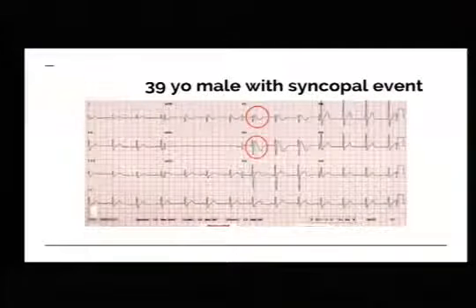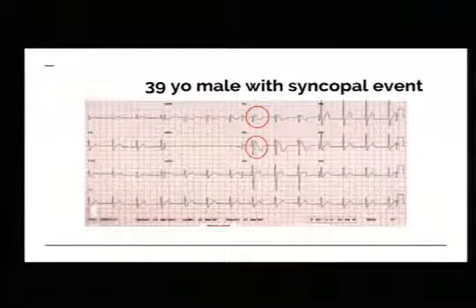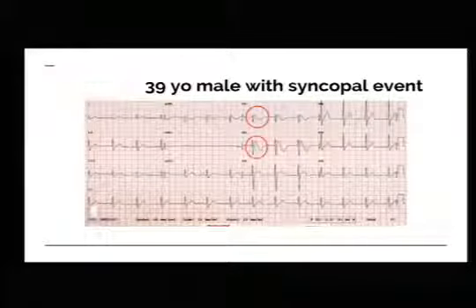This one's circled for you because I couldn't find one without it on there. So 39-year-old male who passed out. Okay. Was just walking across the parking lot and passed out.